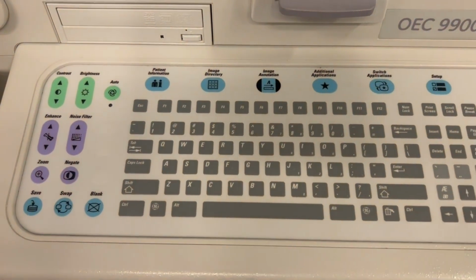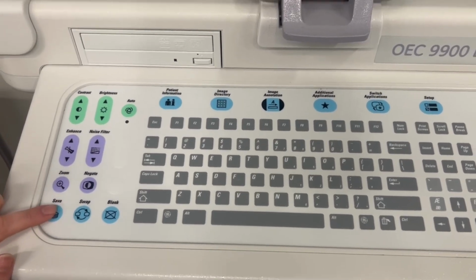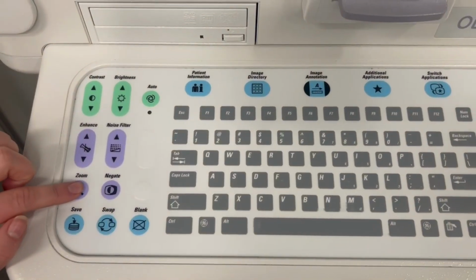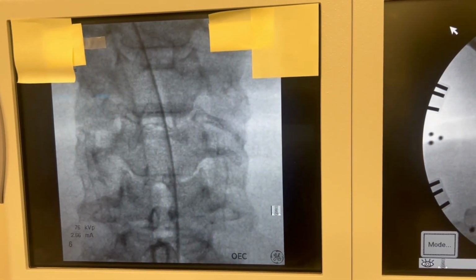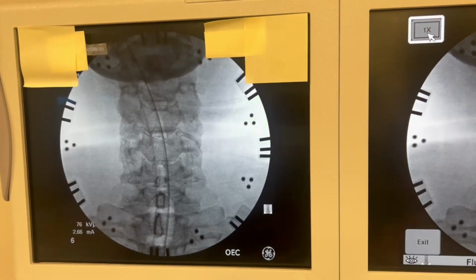The Save button is used during live X-ray or after to save the last image displayed on the left monitor. The Zoom button allows users to zoom in on an image up to 4 times without increasing the X-ray dose. This feature is designed to help clinicians focus on details during surgical procedures.